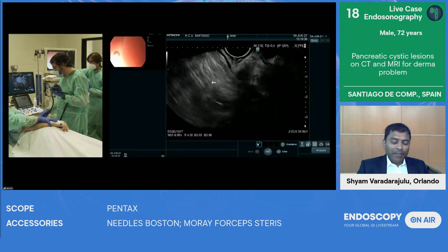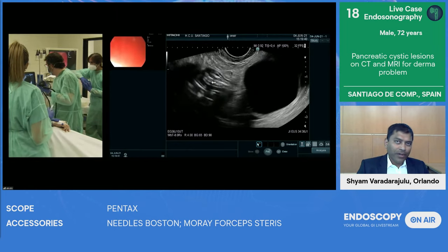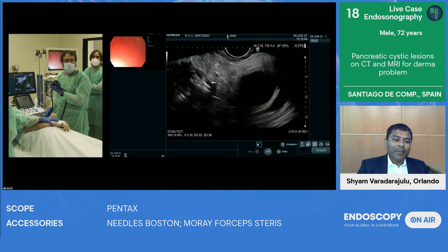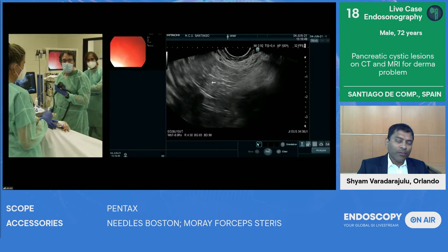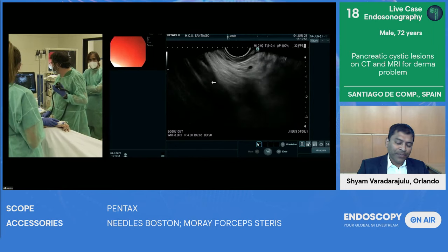I mean, your lesion by EUS was uniformly anechoic. There was not even a question of a mural nodule and so on. So you think injecting contrast will add any value? So are you primarily looking just for a thick wall so that you can target a biopsy?